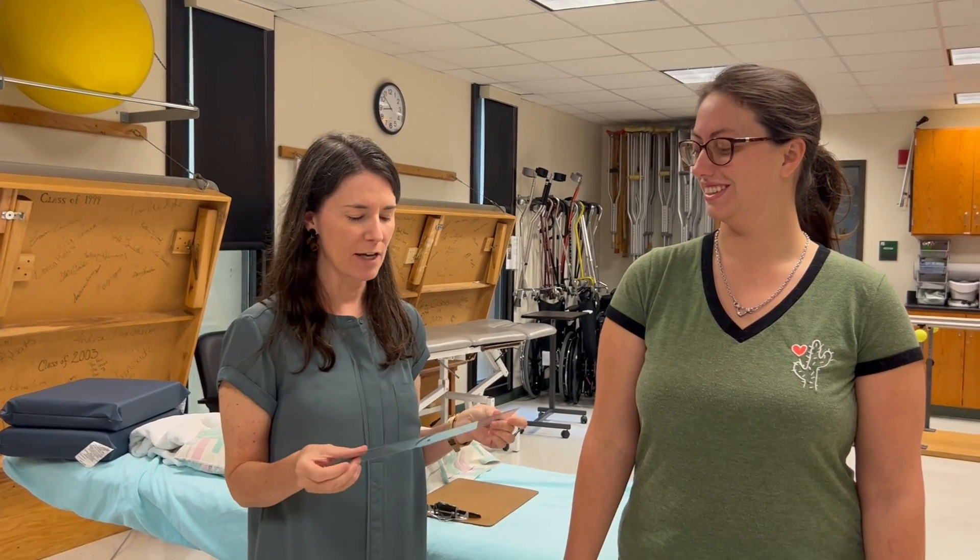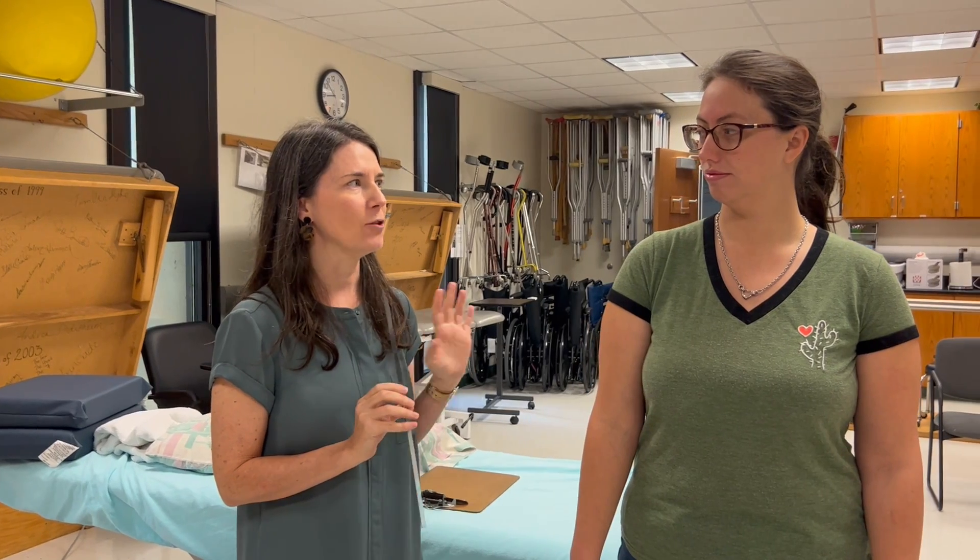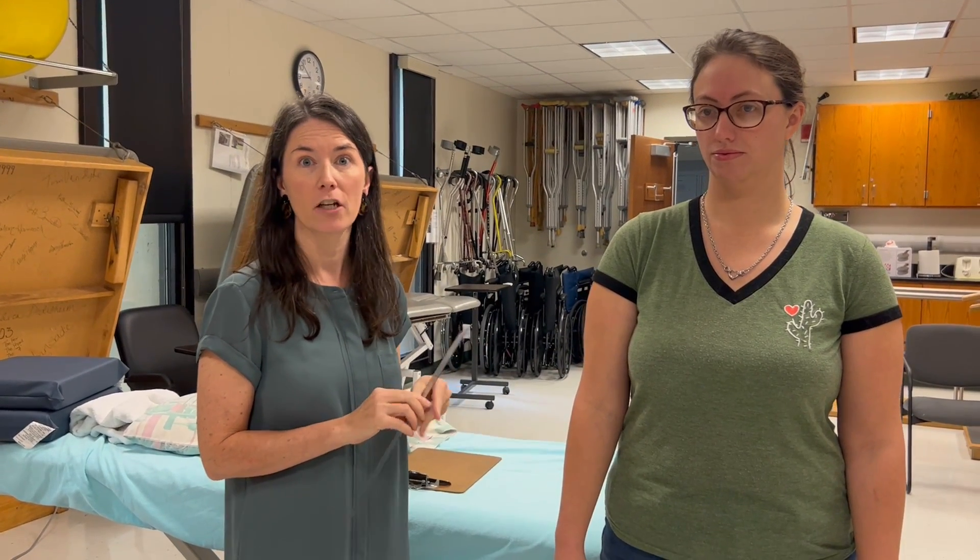In this video I'm going to demonstrate how to measure forearm pronation and supination with a goniometer, followed by manual muscle testing for forearm pronation and supination.